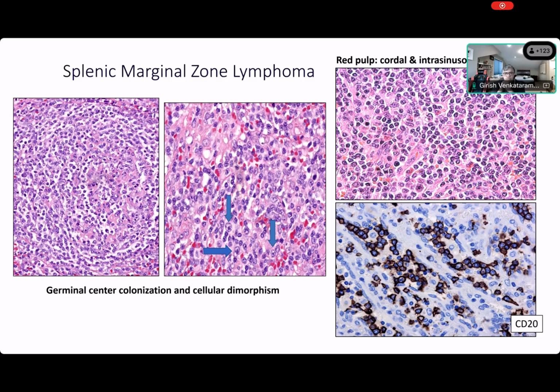So what I'm showing on the left is follicle colonization in the lymph node, and the middle picture with all these bunch of arrows is showing more of a germinal center colonization. I'm not going to say that the picture is easy to understand, but those are all cells showing follicle colonization. Some of the FDCs are being marked over there in the follicles.